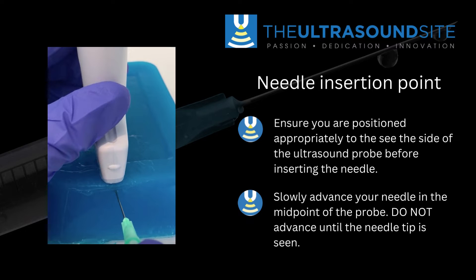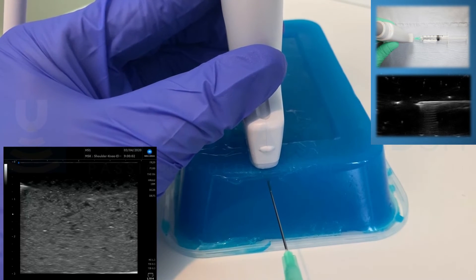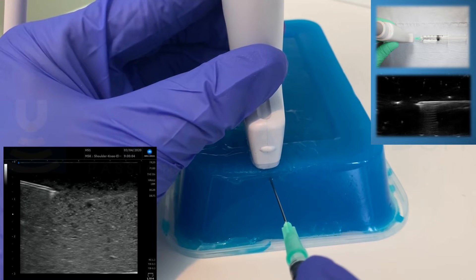Slowly advance your needle tip and ensure that you can see it very clearly on the ultrasound screen prior to advancing that needle tip further in the procedure. You can see here the needle is inserted at the midpoint of the probe, angled away from the probe itself, and it is clearly visualized.